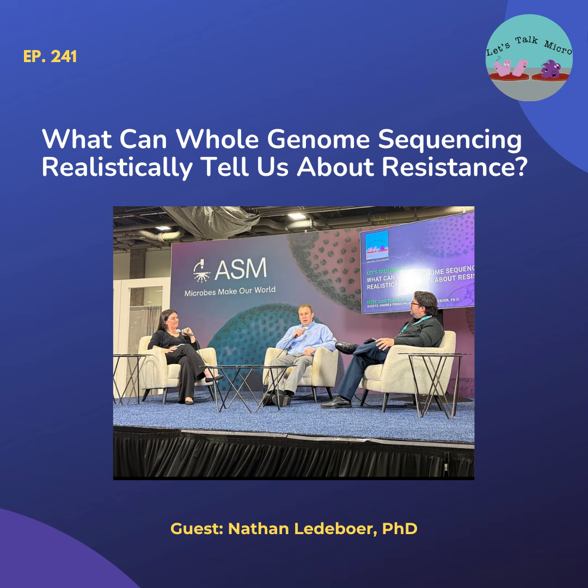Well, I think it's important that we acknowledge not all sequencing is created equal. So you have different approaches to sequencing. So I've seen posters at the meeting here where they're using a probe-based approach using NGS in order to detect mycobacterium at very, very low levels. We're talking 10 to the 1.5, 10 to the 2 range, directly from a clinical sample. Probes give us that tool to really increase that analytical sensitivity, but they limit us in terms of the depth or the information we can get because we don't have the whole genome sequence that we can map.